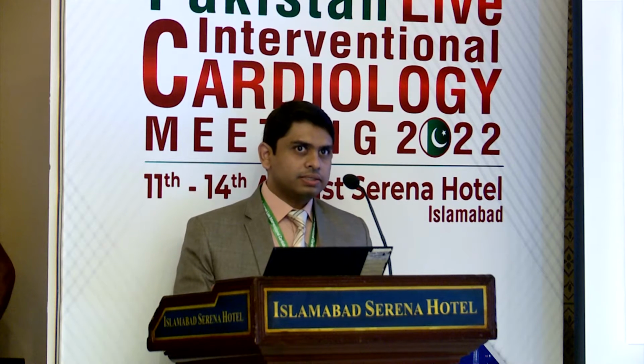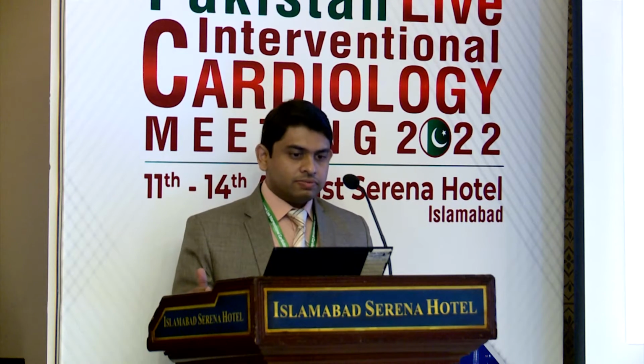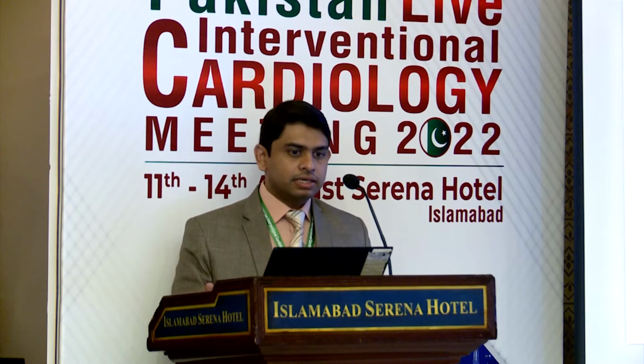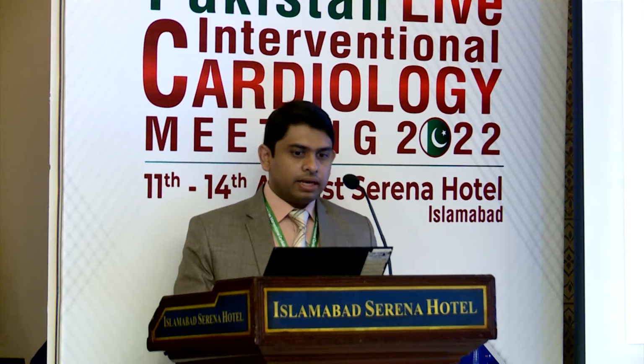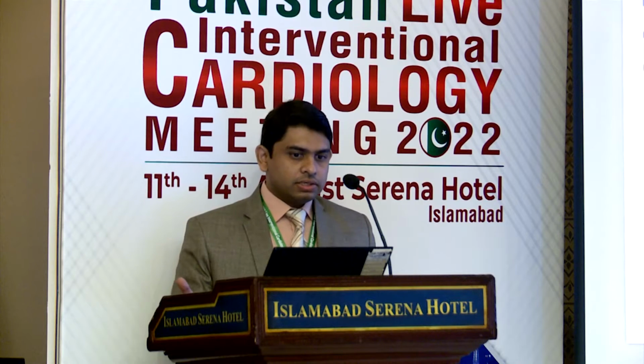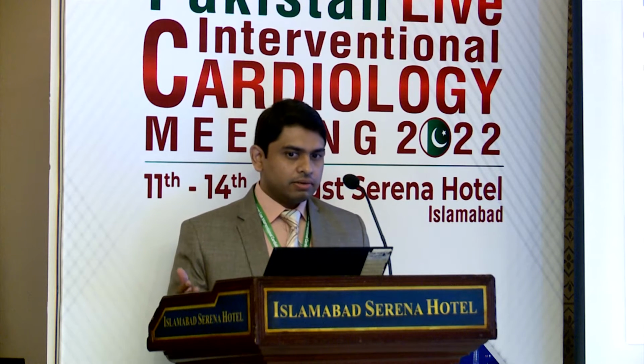First of all, transcutaneous pacing. It is the most rapid, which can be done in less than 1 minute if you have mastered it. We are not routinely trained in this type of pacing. We have defibrillators which have these settings, where we apply pads and do the settings, and we can pace the patient within 1 minute. Equipment provided: the transcutaneous pads are available with the defib machine.